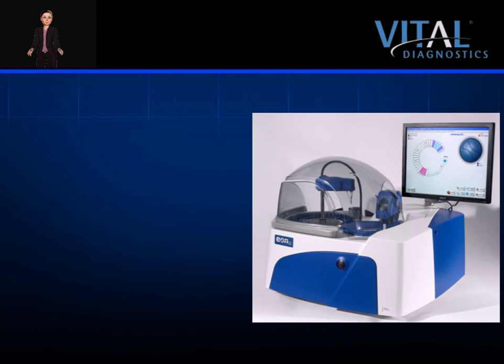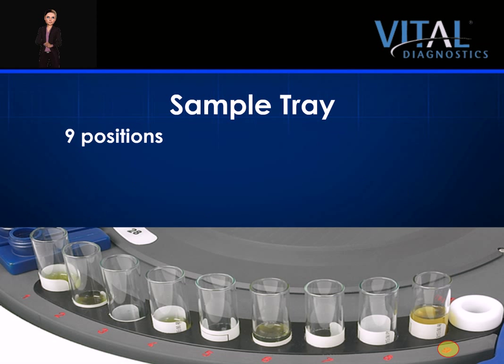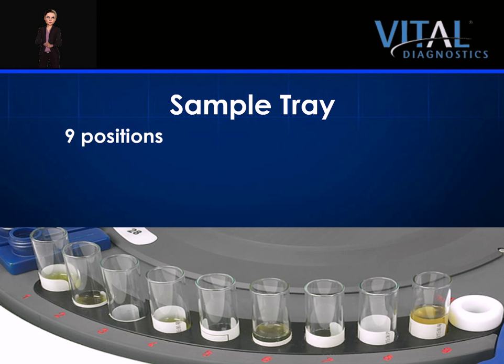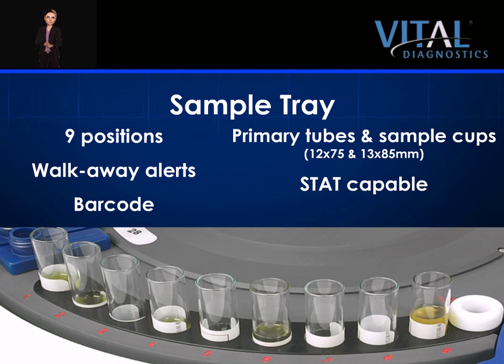The EON100 is capable of performing 180 tests per hour with ISEs. Vital Diagnostics reagents have been approved for either serum or plasma testing. There are nine sample positions located for easy access in the sample tray in the front of the analyzer. The final position in the sample tray is the access port for the ISE module. Samples can be continuously loaded, and alerts on sample status afford the operator extended hands-off time. The system utilizes a barcode reader for primary sample tubes for positive patient identification. Barcodes eliminate data entry error and help decrease processing time. The system accepts 12x75 and 13x85 mm primary tubes with 3 or 5 ml draws, or EON sample cups for low-volume samples. The system accepts stat samples at any time.